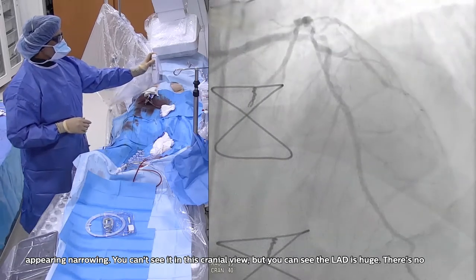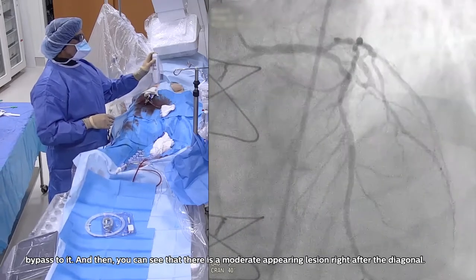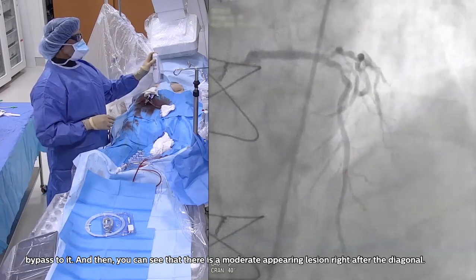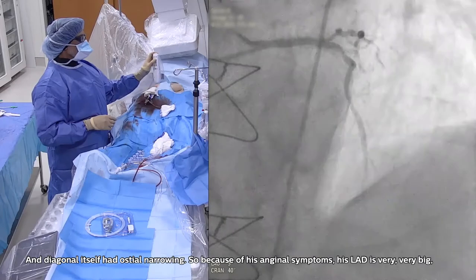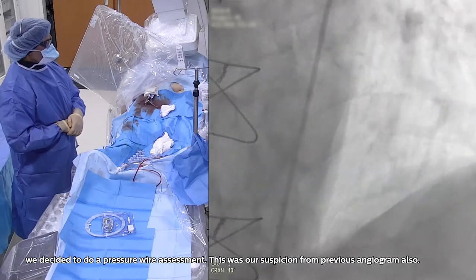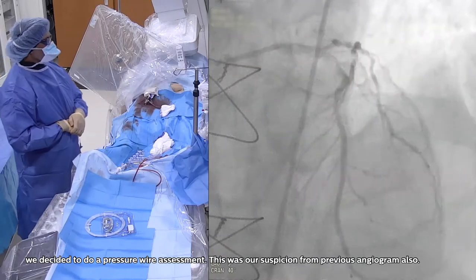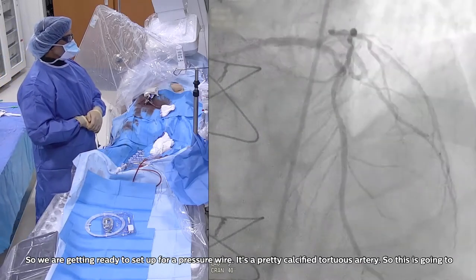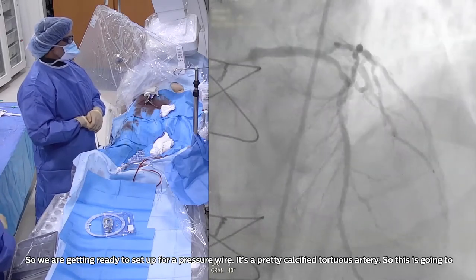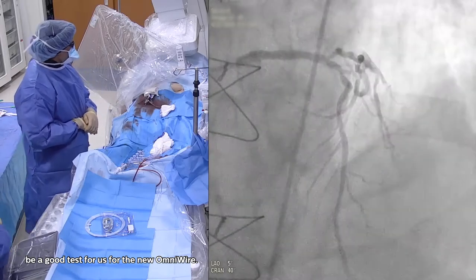You can't see it in this cranial view, but you can see the LAD is huge. There's no bypass to it. And then you can see that there is a moderate appearing lesion right after the diagonal, and the diagonal itself has ostial narrowing. So because of his anginal symptoms, and his LAD being very, very big, we decided to do a pressure wire assessment. This was our suspicion from the previous angiogram also. So we are getting ready to set up for the pressure wire. It's a pretty calcified tortuous artery, so this is going to be a good test for us for the new Omni Wire.